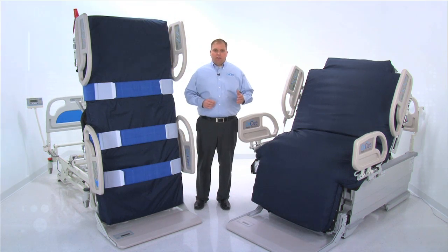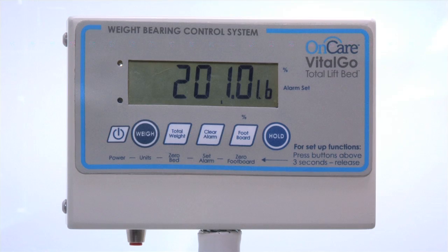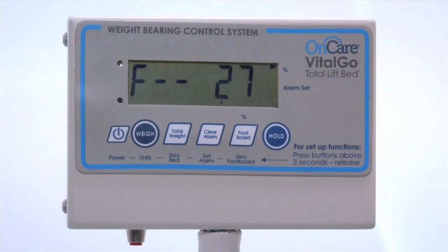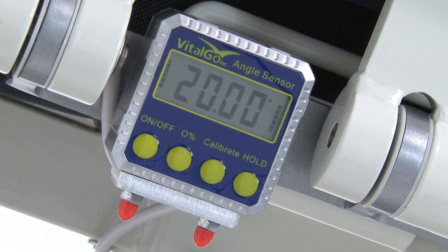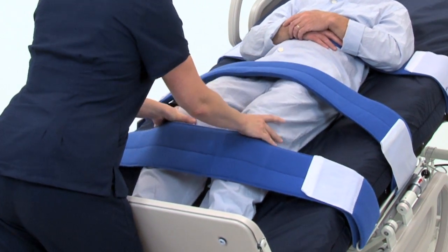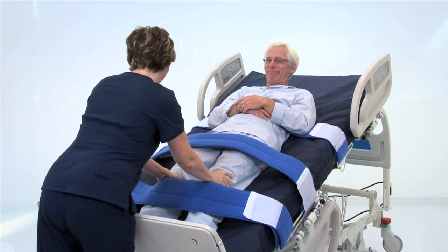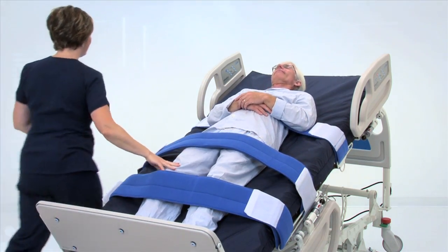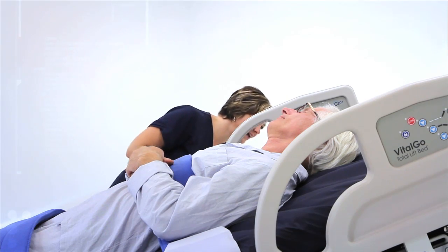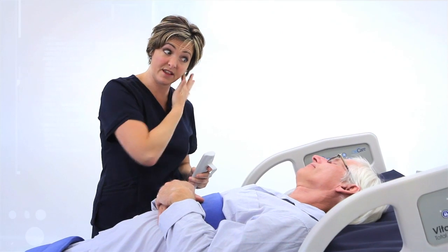With the Total Lift Bed, therapists no longer need to rely on guesswork to determine a patient's weight-bearing ratio. A patented system displays the percentage of weight a patient is bearing. The angle of tilt is also displayed on the inclinometer. With the Total Lift Bed, caregivers can now set a baseline for early mobility therapy based on tolerance or vital sign changes. Jerry, your blood pressure is looking a little on the low side, so we're going to lay you back down. You're at a 20-degree angle today and we did 15 repetitions of five different exercises — excellent.